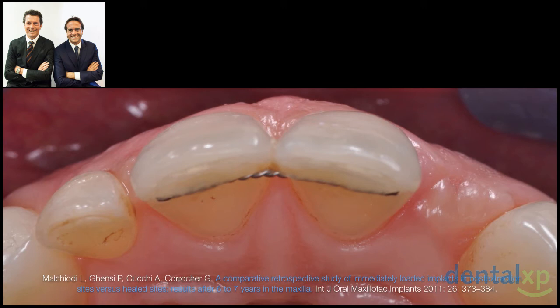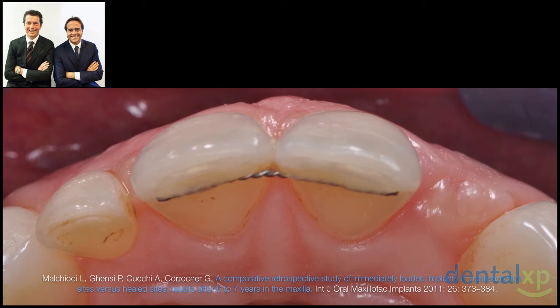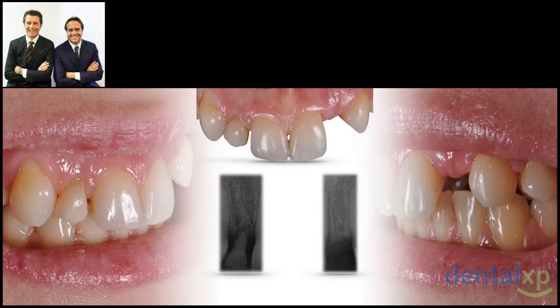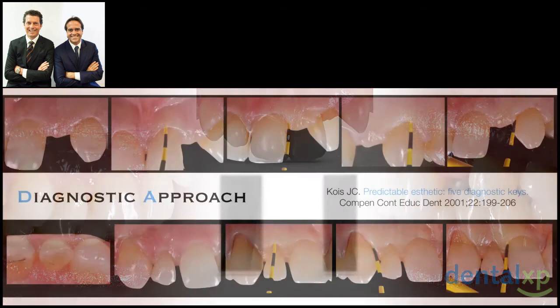Now let's consider a case that appears similar — one post-extraction site and one healed ridge — but is located in the lateral incisor area. It is only apparently similar, because here we are in the anterior aesthetic zone with a thin gingival biotype. In the previous case the goal was mainly to maintain the inter-implant papilla; here our goal is to maintain the overall buccal-palatal volume. Buccal-palatal collapse of the ridge is a significant challenge in restorative and implant dentistry. The aesthetic risk profile for this young patient was extremely high, as shown by the exposure of the transition zone.